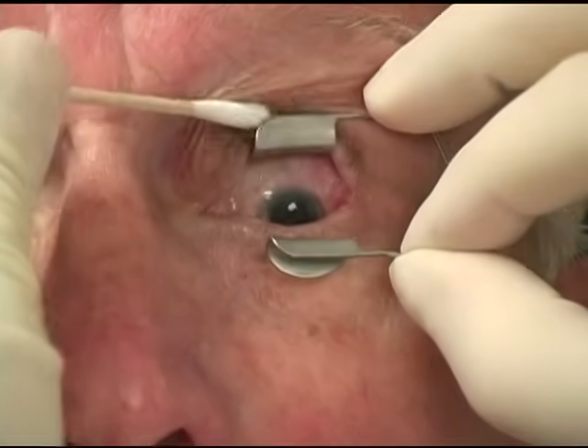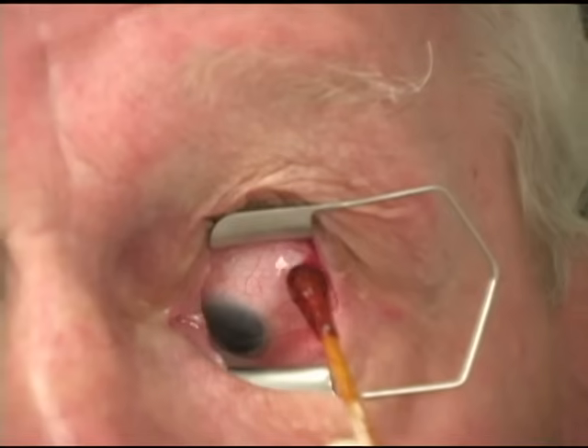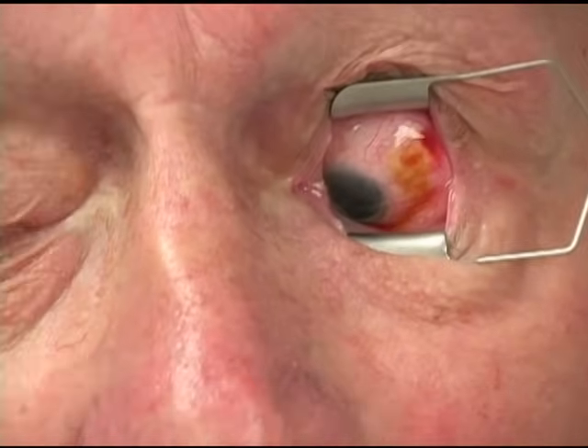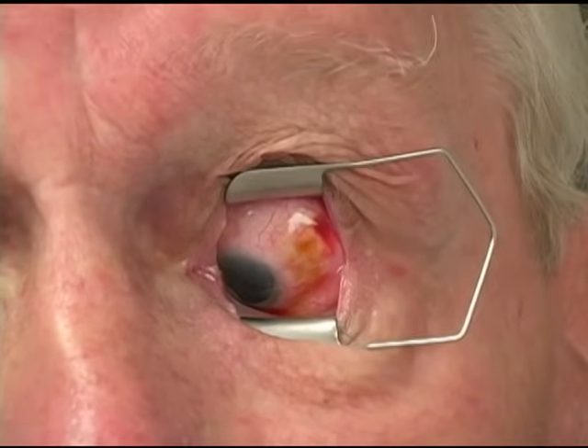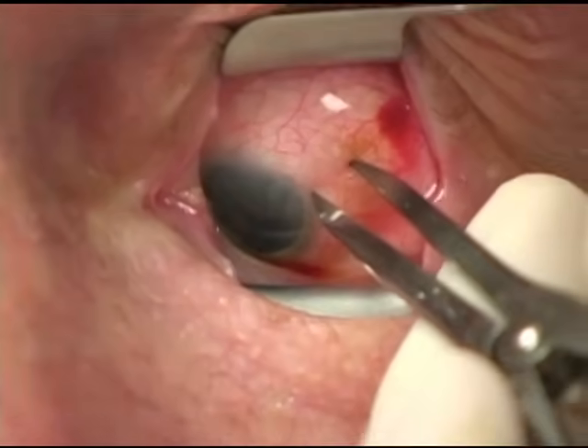A lidded speculum is inserted into the eye. An area 3.5 millimeters from the limbus is marked with calipers, and we often reapply 5% povidone iodine prior to injection.